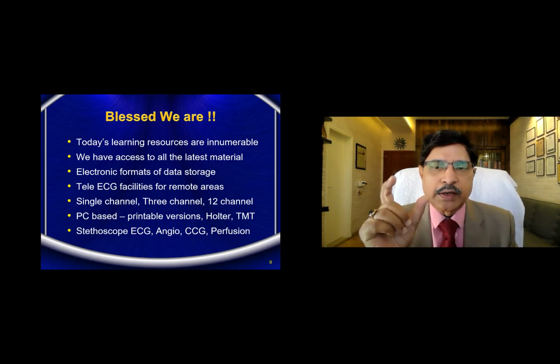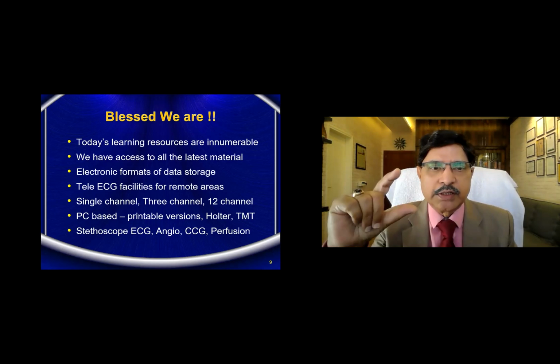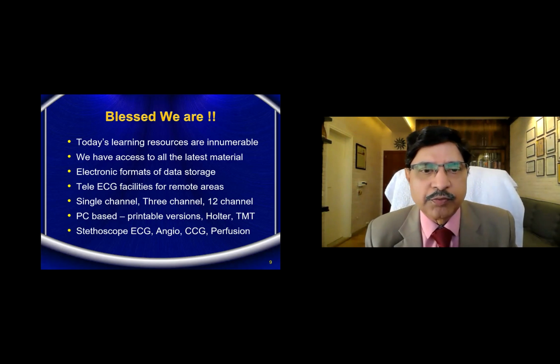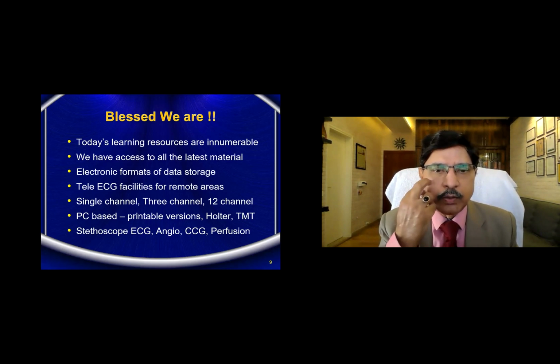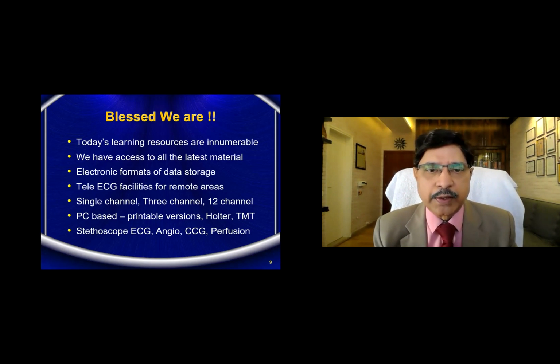And I also have a very tiny portable ECG. The machine is only this size. You can put it in the pocket and go to any field. And you see coronary angiograms and perfusion studies. When I say TMT here, I would like to run 1 or 2 sessions on TMT also, because majority of the postgraduates are not familiar how to actually do the TMT and also interpret the TMT. And you can actually do it in your wards, and along with hands-on experience from here, I can demonstrate to you about the TMT, which is a little outside the scope of ECG, but in the broader sense, of course, it is also ECG.